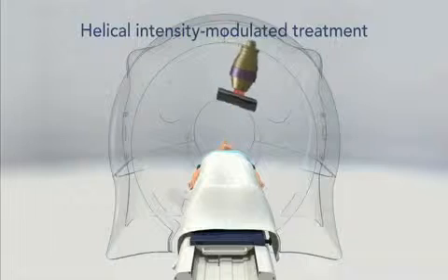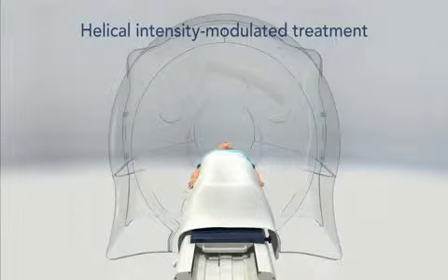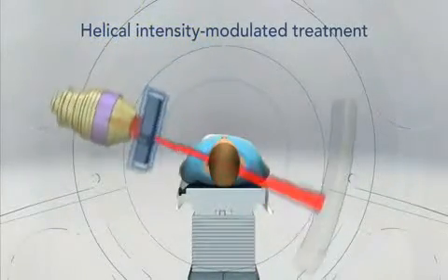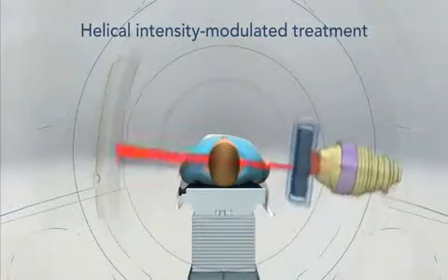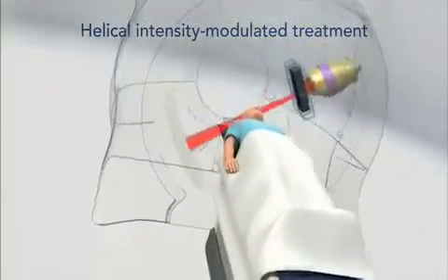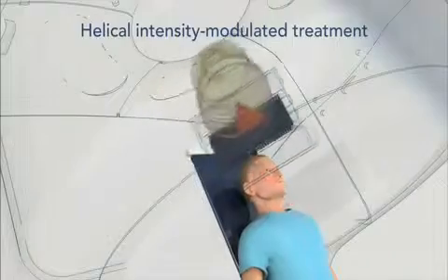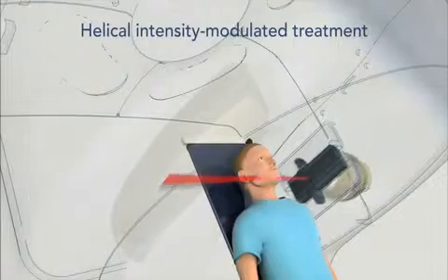For treatment delivery, the same helical rotations of the X-ray beam source are used. This time, however, the intensity of the beam is changed rapidly during each rotation, according to the shape of the tumor, using thin tungsten leaves that block or unblock the beam. The 64 leaves in our unique binary multileaf collimator create tens of thousands of optimized 6-millimeter-wide beam elements known as beamlets. This unique combination of a helically rotating beam source and beamlet-based delivery is what distinguishes TomoTherapy treatment from other forms of intensity-modulated radiotherapy.